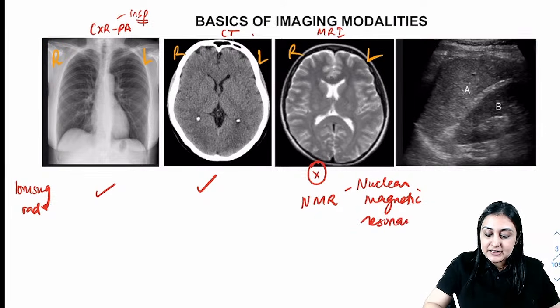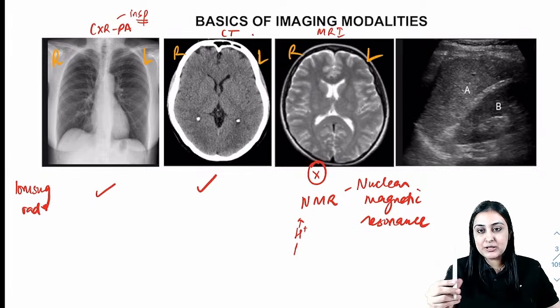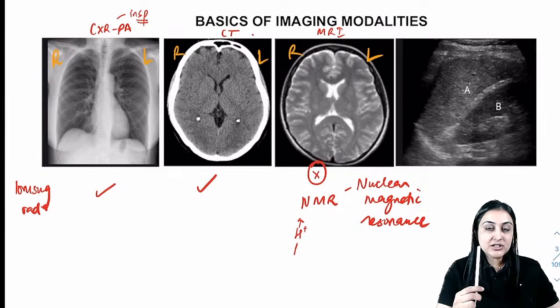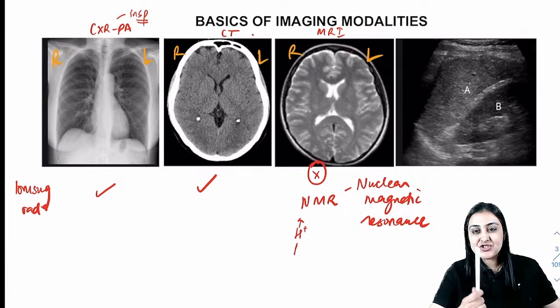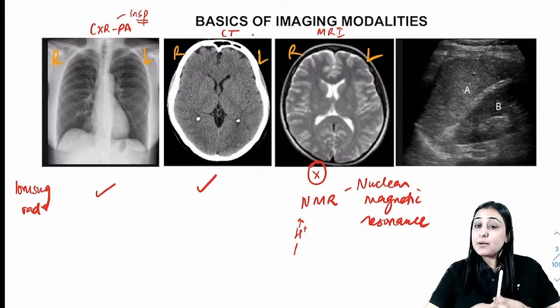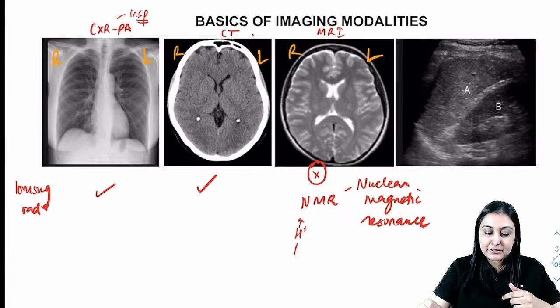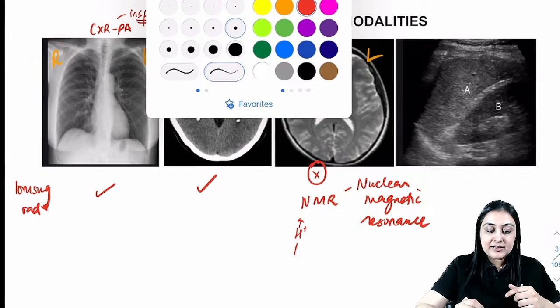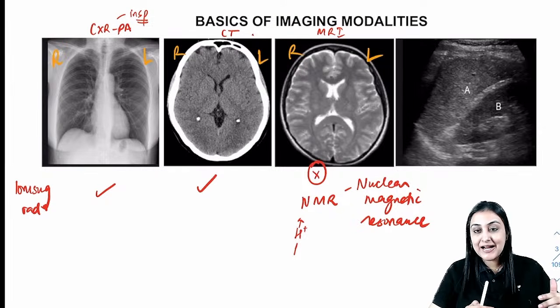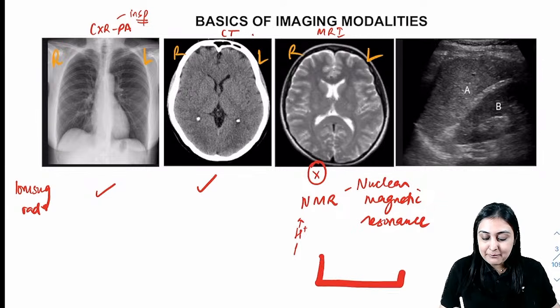So what happens in MRI? Listen carefully. In MRI, I have all of these protons in my body, right? We have these protons which are all spinning on their axis. So imagine this pen. Can you see this pen? This is a proton's axis. All of these protons are spinning on their own axis. Whenever a charged particle spins on its own axis, as you have studied in physics, it generates a tiny magnet, right? So in our body, we have all of these tiny magnets which are all spinning throughout the body. But is there an overall magnetic vector which is generated? No, because something is spinning in this axis, somebody is spinning anti, opposite to it. So overall, I'll make the pen thick, don't worry, fine. So overall what is happening is that the net magnetic vector is cancelled out, all right? So overall the net magnetic vector becomes 0. But when I place this person in a large magnetic field, what happens in MRI? Pen thick enough?